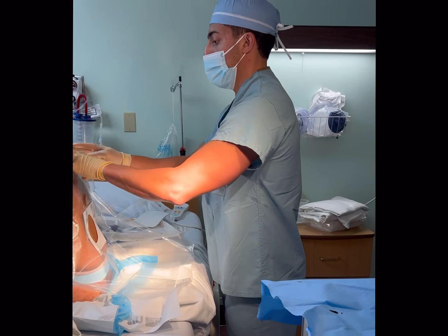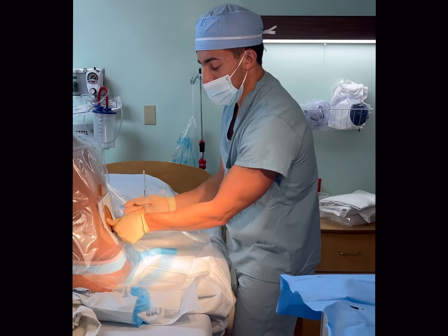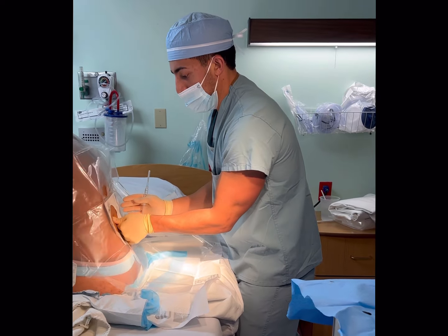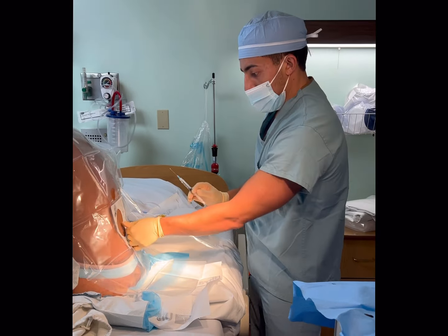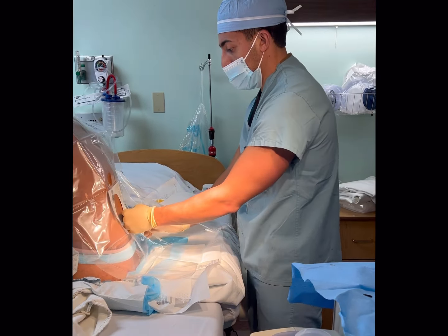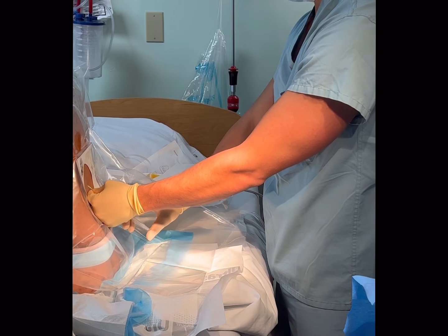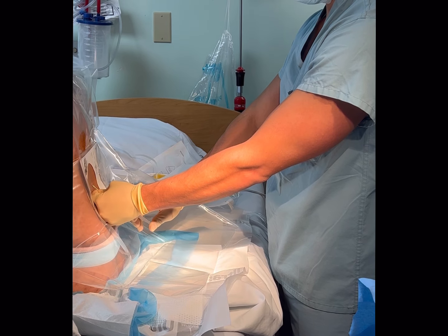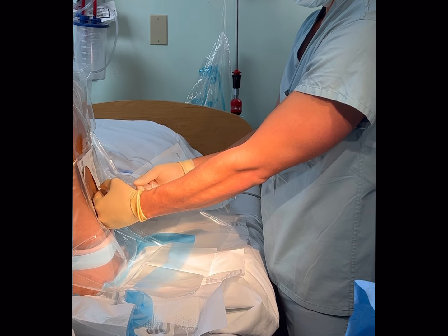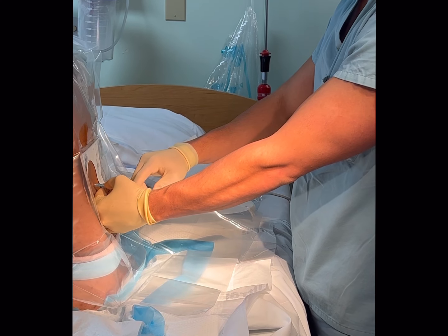Chin to your chest and lean forward for me. A lot of times when you tell them to lean forward, they just get into that position without really having to elaborate. So I'm going to do some local anesthesia right on my nail mark. Tiny little poke — this is very sudden. A little burn is normal. This is just my skin wheal here, and I actually use this to kind of find a trajectory. A little bit of pressure is normal. I like that trajectory there.